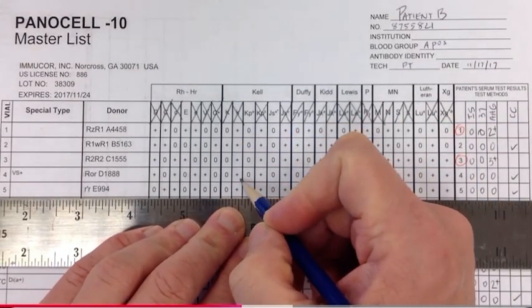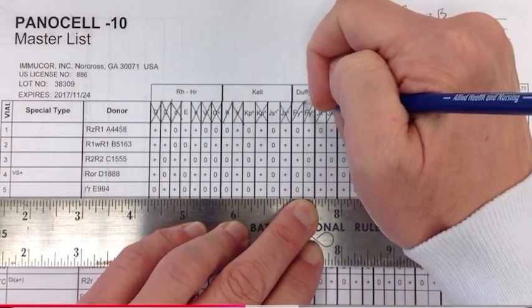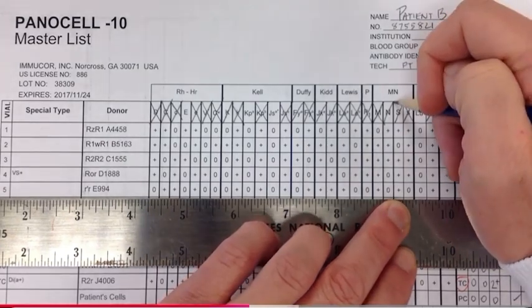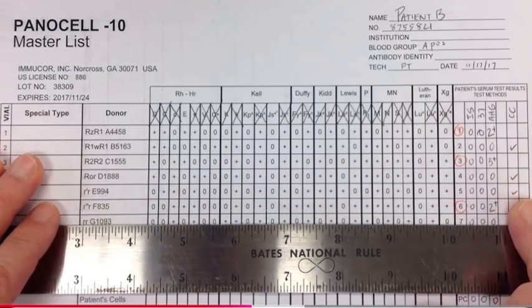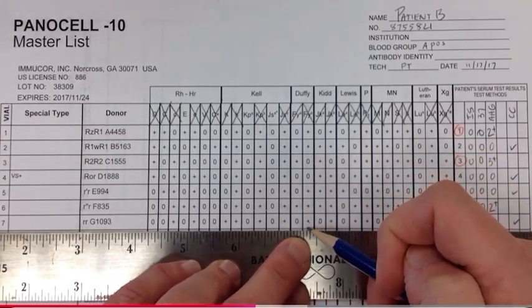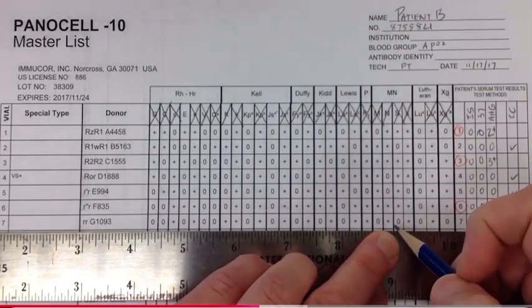Okay. Okay, Duffy B, homozygous. Okay, big S, homozygous. Let's go to 7. Okay, Kid B, homozygous. Oh, man.